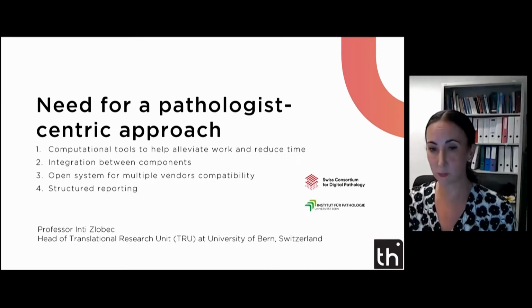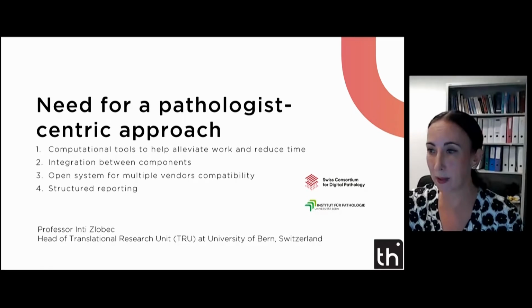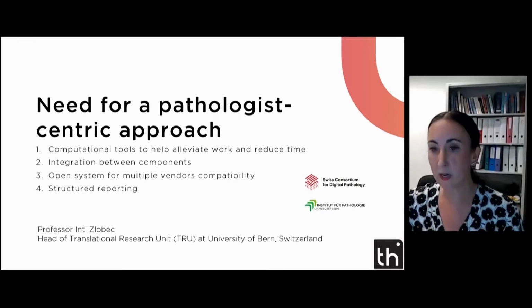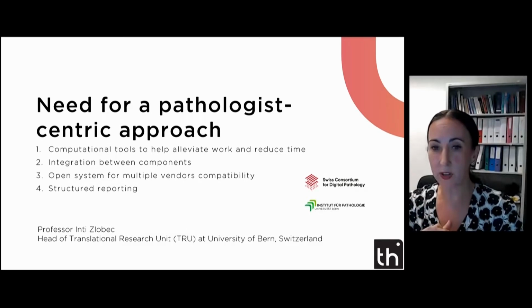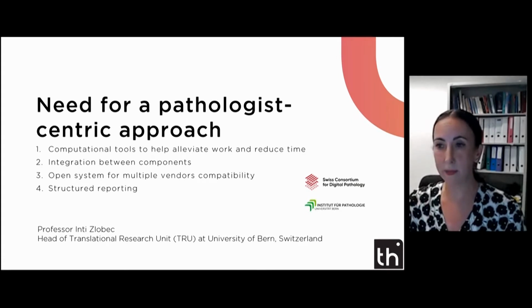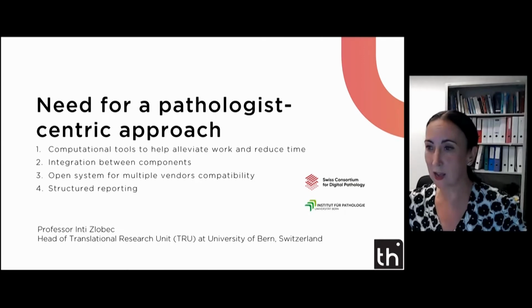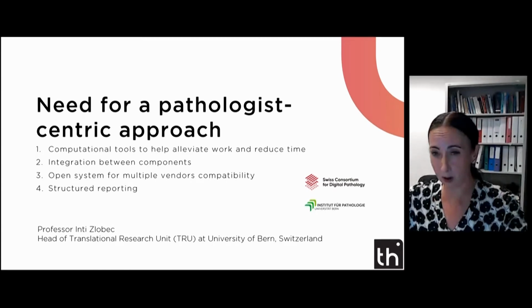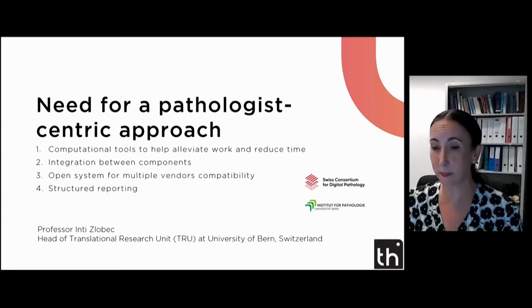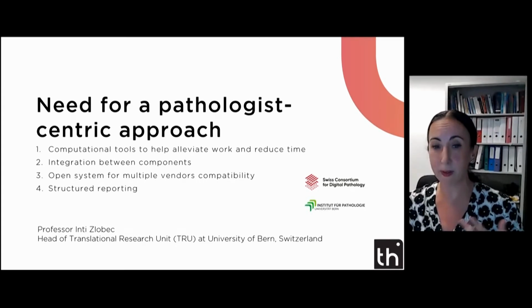So that whole process, which can be a paperless transmission, can affect every single step in the lab, from improper barcoding, to cutting sections that are too thick, to making sure that the dyes or the colors in the lab stay the same over time. Thick sections, for instance, can all affect how the scanner is going to take its focus points. All of those are pre-analytical variables. This is even way before the slide or the scan shows up in the pathologist's IMS. That's really the seamless workflow that we're talking about from beginning to end. So it's easy to forget that point.